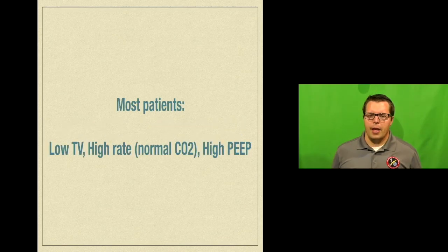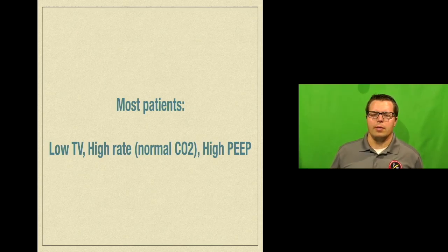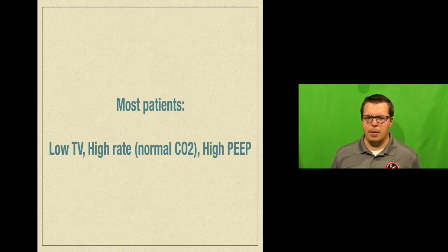For most patients, head injury patients, vomiting patients, aspiration patients, pneumonia patients, CHF patients, we are going to use a strategy of a low tidal volume, a relatively high rate to maintain a normal CO2, and a relatively high PEEP on these folks to avoid damaging their lungs.